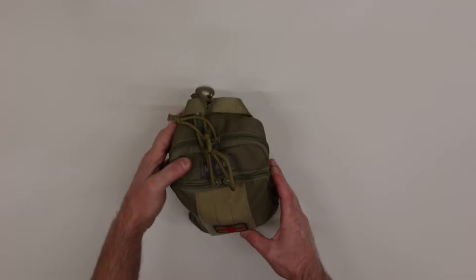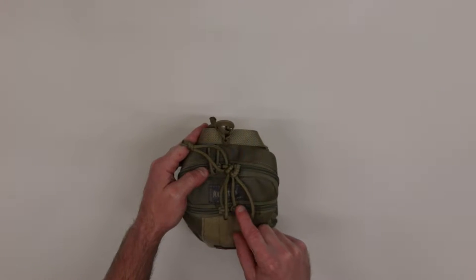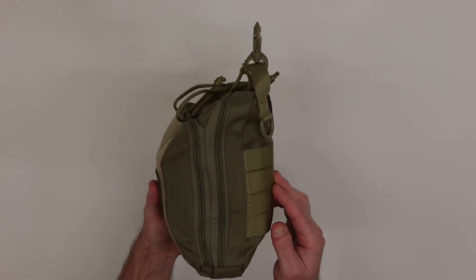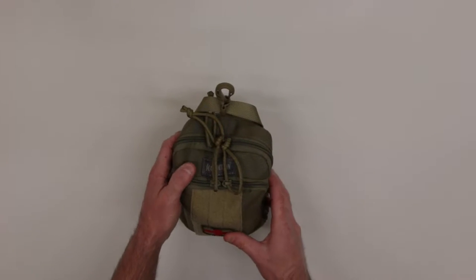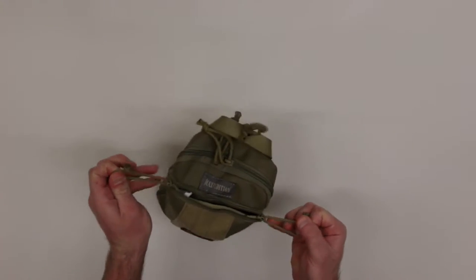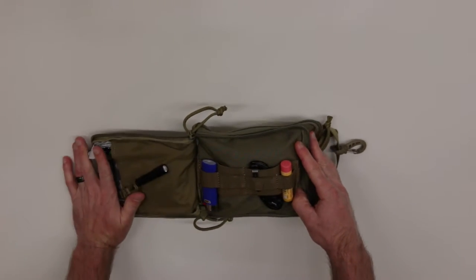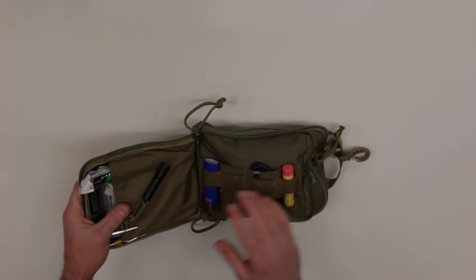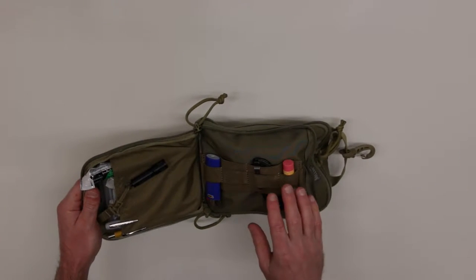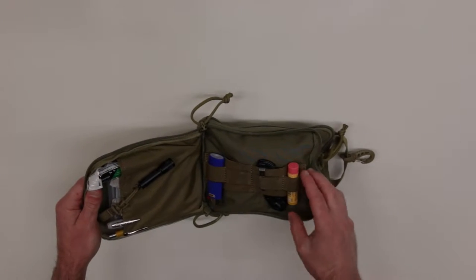Starting with the outside pouch, both pouches have a YKK zipper, which is a high-quality, self-lubricating zipper. I have this IFAC pretty much filled to the brim, so it's nice to have a high-quality zipper. This particular side I have designated for more of a basic first aid kit. It opens up like a clamshell to easily see both sides of the pouch, and it has elastic webbing oriented in a horizontal position.